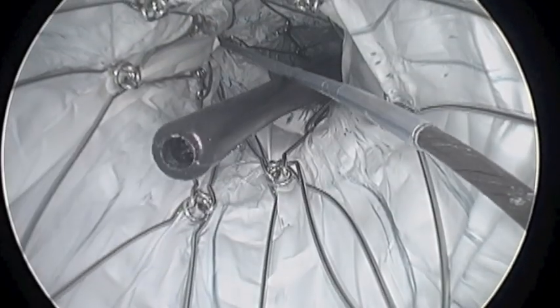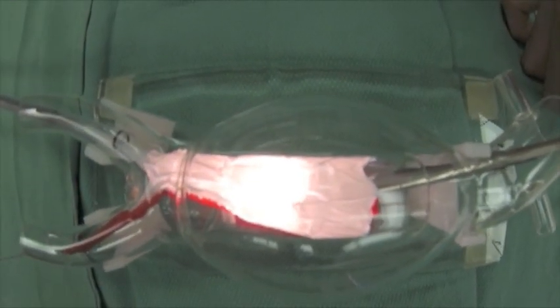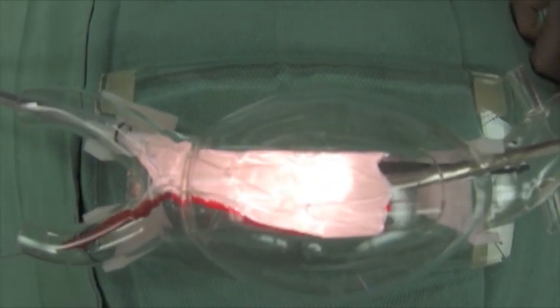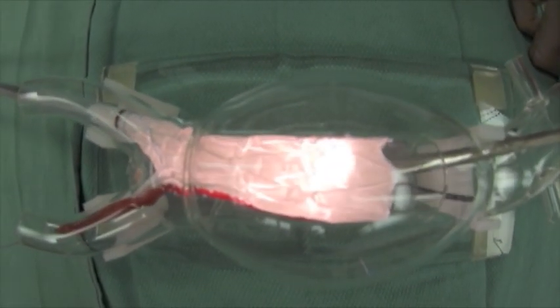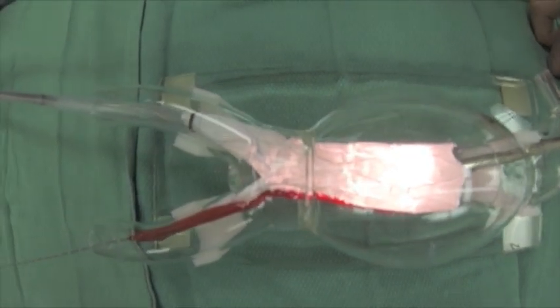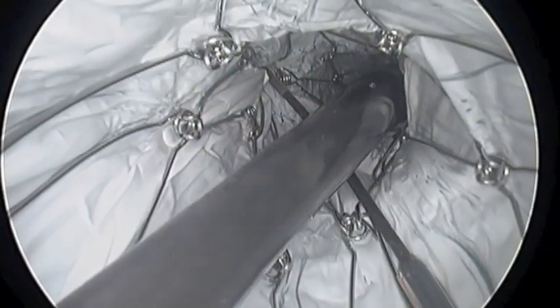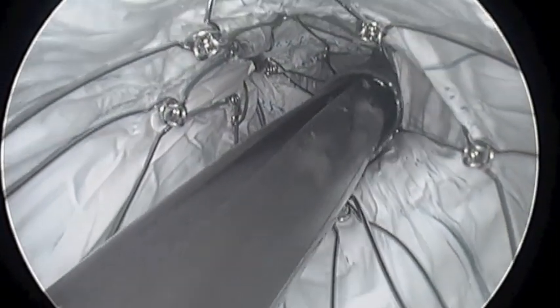Here the ipsilateral limb is deployed. This is a view from the outside. You want to make sure the sheath is pulled back to where the limb can be deployed completely.